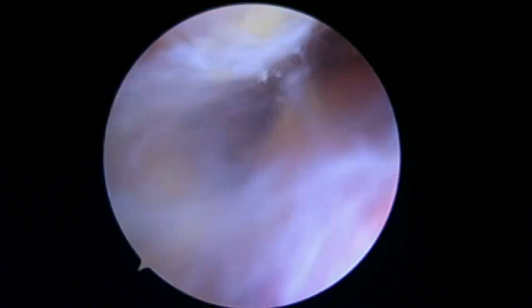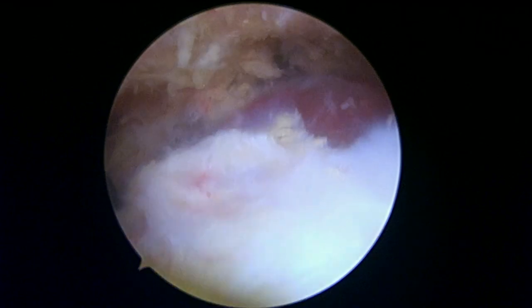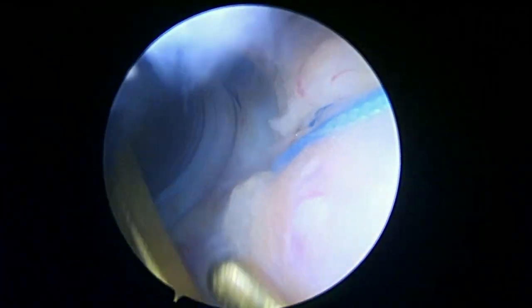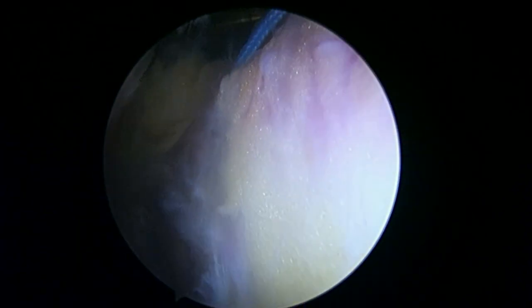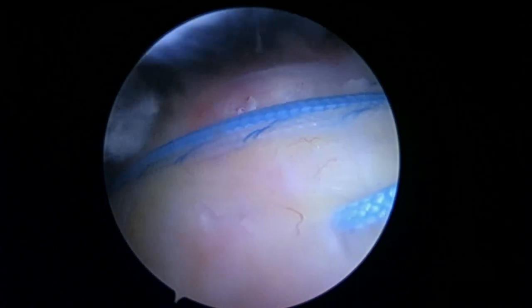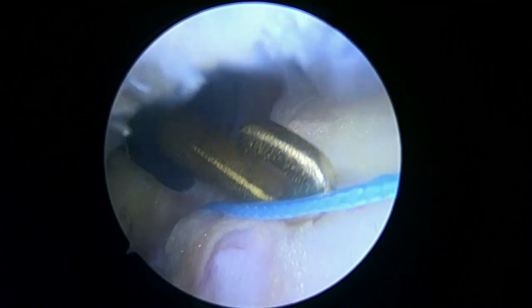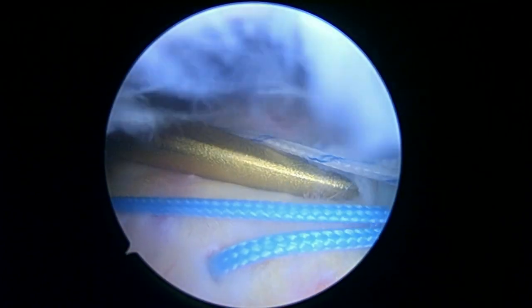Now we're looking at the subacromial space — we've done our decompression, which is our work on the bone spur or anything that could pinch on the rotator cuff. Now we're getting a good look at where we put those sutures — here they are. As I hold tight with the camera — hold still and rotate your shoulder — there's no sign of any cuff tearing on this side. It was just on that articular side. We're going to tie these rip stop sutures and that should do the trick. There's the work on the bone there, and that looks good. We did a little bit of work on the clavicle also, which we often have to do. We're going to go ahead now and take these sutures one set at a time, starting with the blue and white ones. You can see how we retrieve those so they're now inside the cannula — we're going to tie those in just a minute.